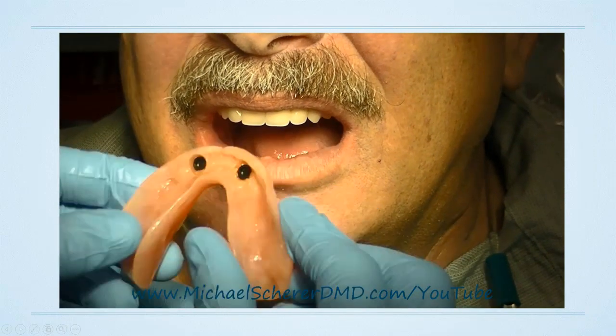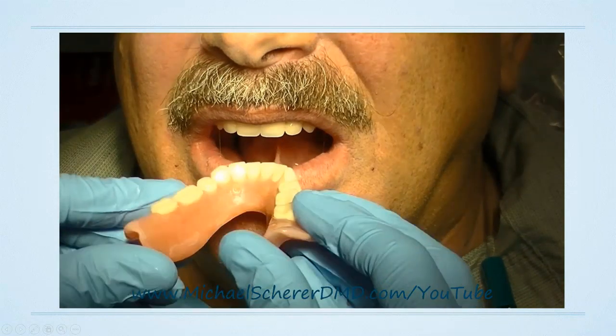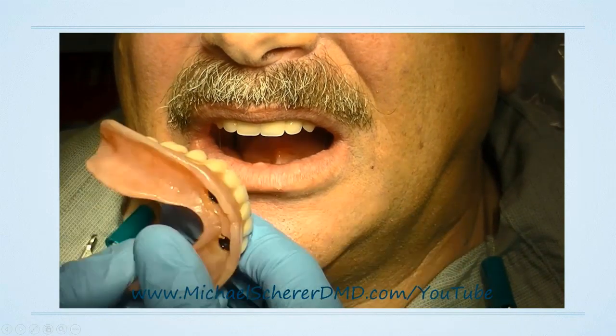Once I've had that material set up fully, I remove it from the mouth, and you can see here I had a perfect pickup. A little bit of excess material has flowed out the lingual, exactly how I want it to look.